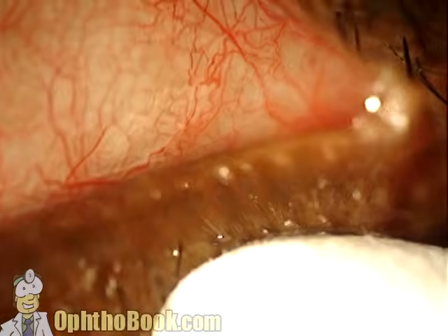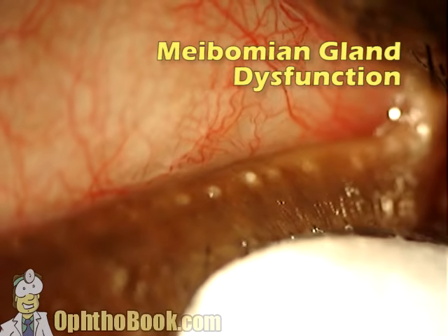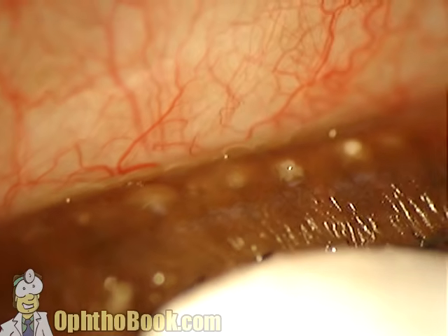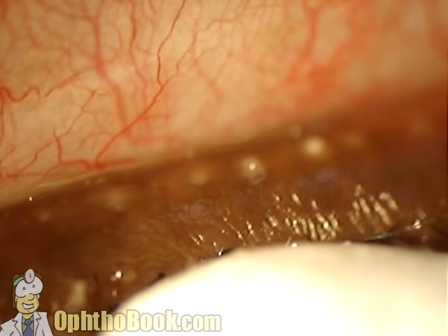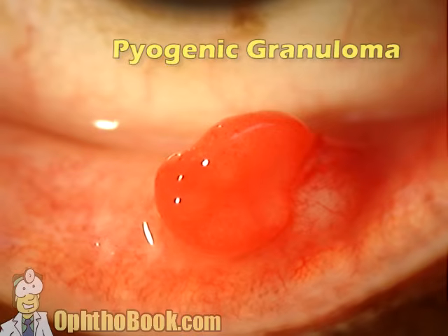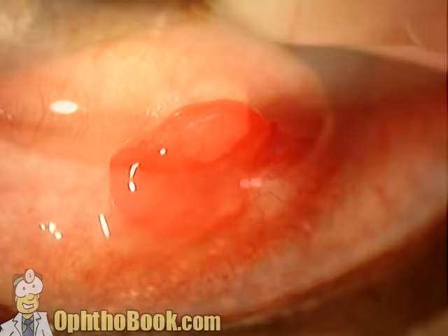This is a case more of a posterior blepharitis, where the meibomian glands become clogged up, and when we push with our Q-tip, you can see that whitish, oily material just kind of oozing out, causing a lot of issues. Why do I flip the eyelid? Because sometimes you have things like pyogenic granulomas, which is associated with chalazions.